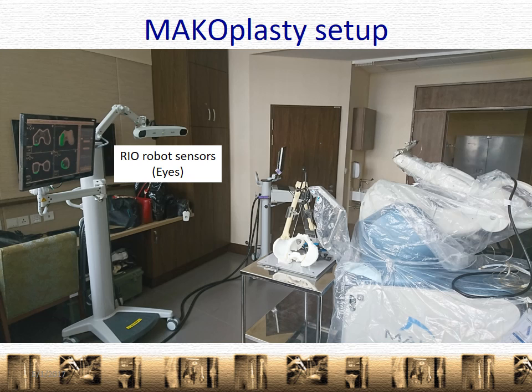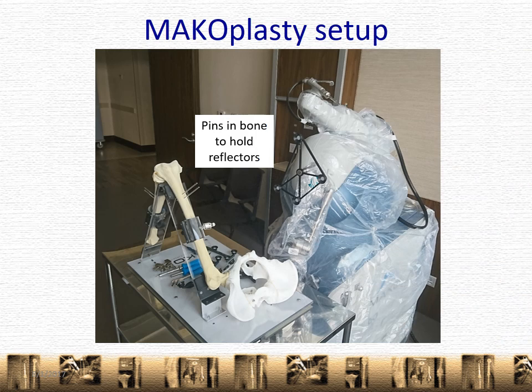As I mentioned earlier, this is what happens: the light actually comes in from the surrounding, reflects off here and goes into the sensor, and so the robot is able to know where the limb is. For the description, we have set up the saw bones in this way. These pins that you see here are used to hold the reflectors that will be used by the computer and the robot to see where the limb is in space.